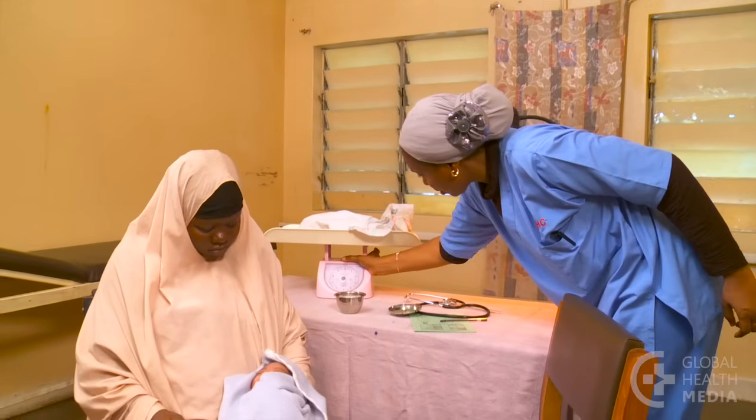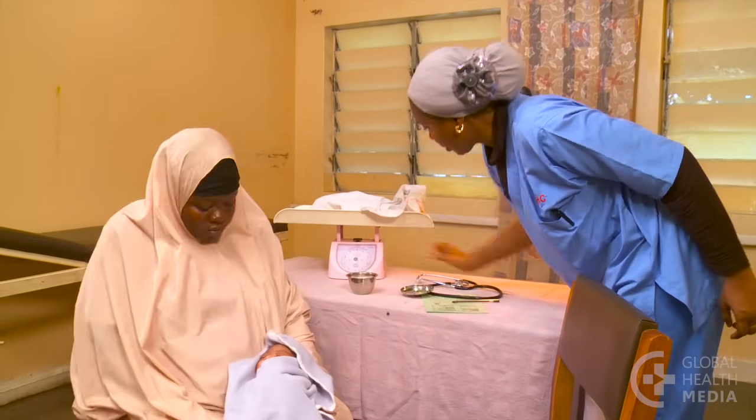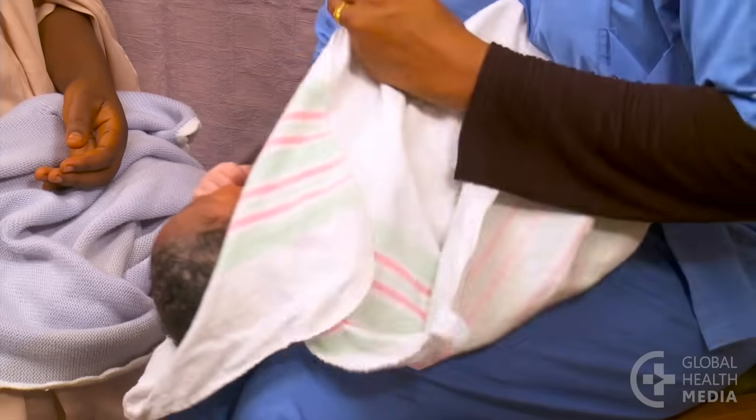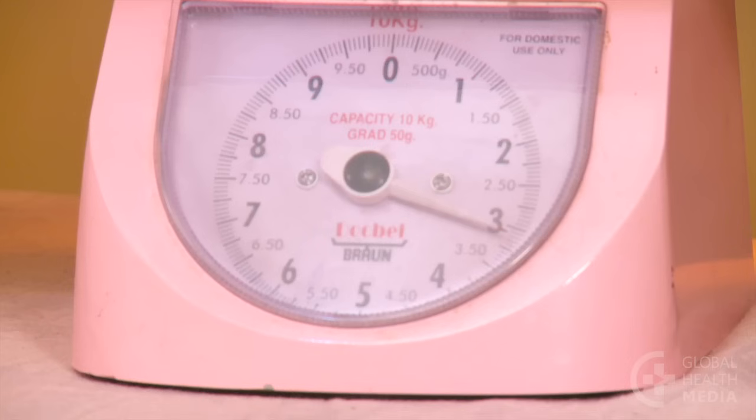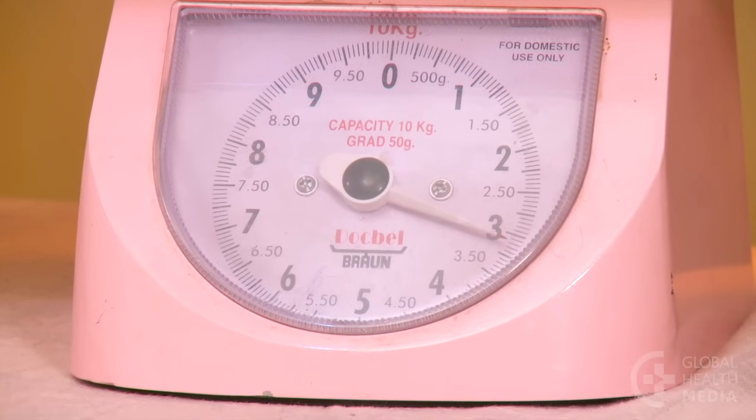Doses for babies are based on the baby's weight. Start by getting an accurate weight. The baby weighs 3.2 kilos.